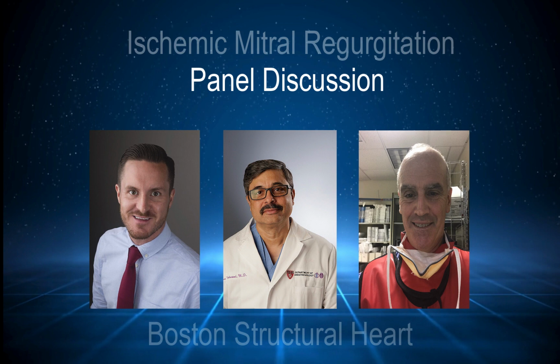How hard would it be to his resident? Trust me. Yeah. Well, for the mitral clips, you routinely measure a valve area. Absolutely. No matter how big the valve area is, because if you tell the proceduralist we're starting at 7, which is huge, then all of a sudden the amount of clips and the amount of repair you can do goes up, which is fine, right? Because you have more room.